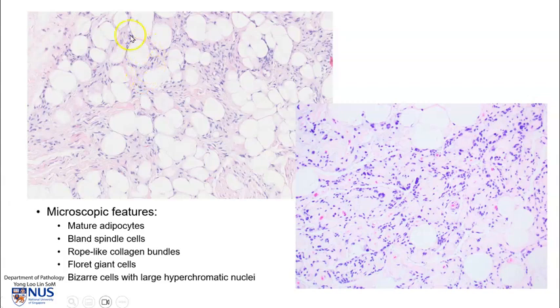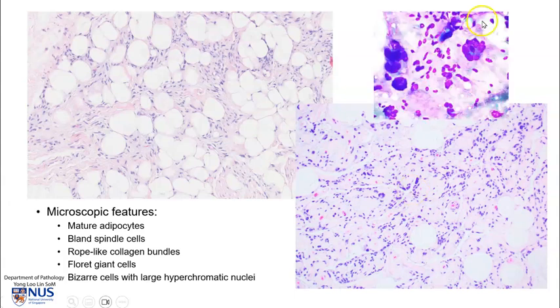Microscopically, there are also lots of mature adipocytes, but at the same time there are these spindle cells which look very bland, and they are arranged in short parallel bundles. There is also often pink ropey collagen in between the adipocytes. Here is the pleomorphic lipoma area where we can see some multi-nucleated giant cells. The nuclei can be arranged in a sort of a circle, and these are known as floret cells or floret giant cells. Sometimes there are also large cells with hyperchromatic bizarre nuclei, hence the name pleomorphic lipoma.